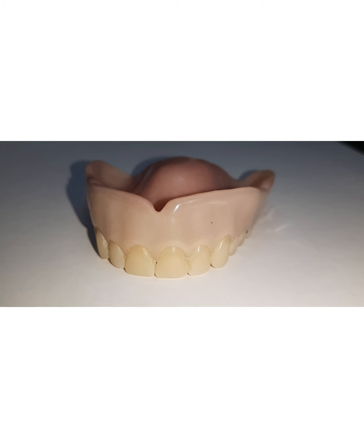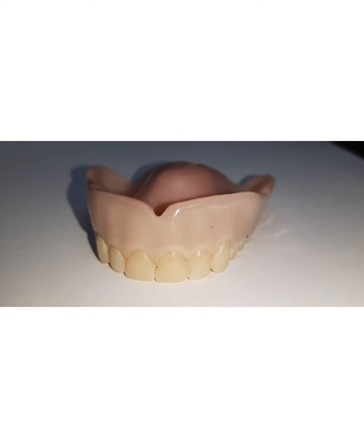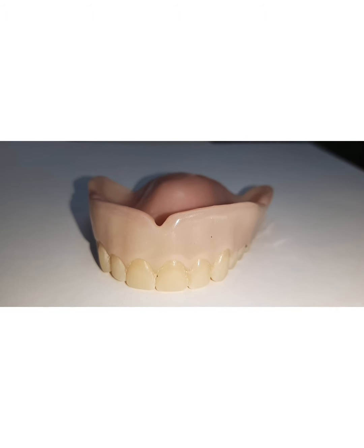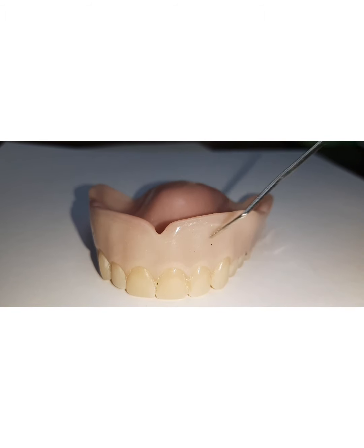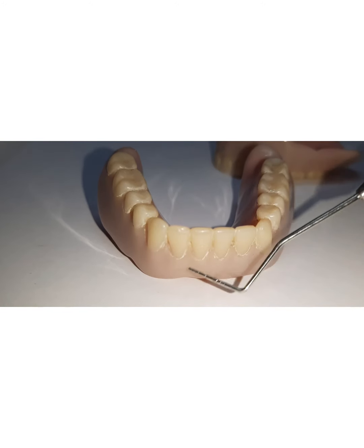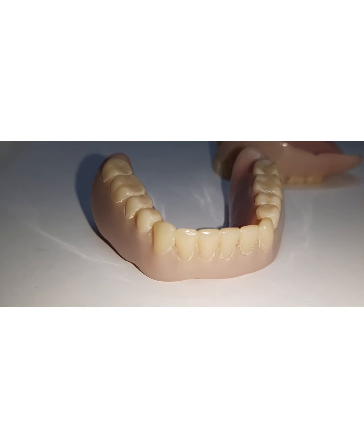Part of complete denture is the denture flange. It is defined as that part of the denture base that extends from the cervical end of the teeth to the denture border. That is, if you can see here, the cervical end of the denture teeth to the denture border. So this entire area is the denture flange. In the upper denture, the denture flange includes the labial surface and the buccal surface. And in the lower, you have the labial flange, the buccal flange, and the lingual flange. This is the lingual flange.